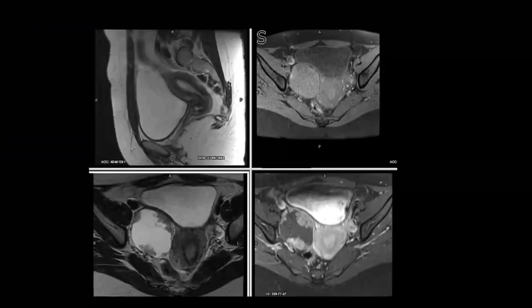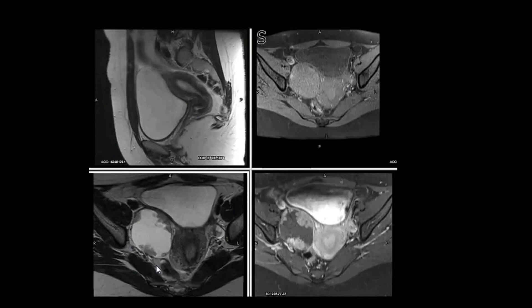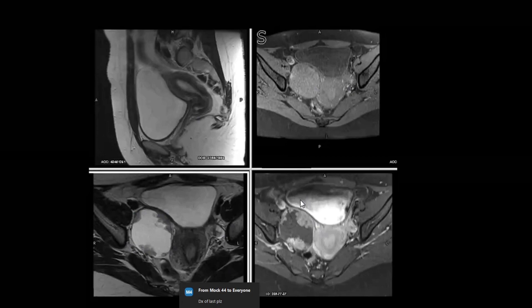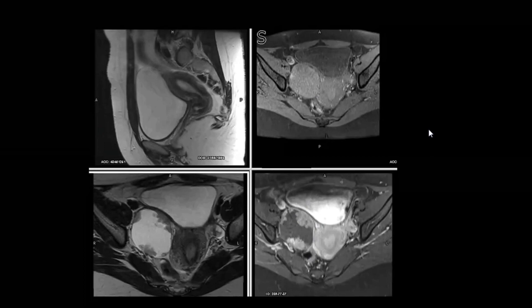Another case — MRI examination. This patient was undergoing treatment for infertility and came to us for ultrasound. We found an enlarged ovary with an internal solid component. The MRI shows the right ovary is enlarged with hypointense internal nodules, which are solid nodules showing enhancement and was labeled as a neoplastic lesion. Whenever you look at an ovarian cyst, you have to differentiate and mention in your report whether there are any septations, the thickness of the septations, the internal solid component, and if it is a CT or MR examination, whether there is any contrast enhancement.